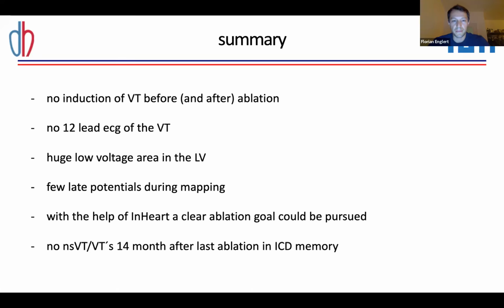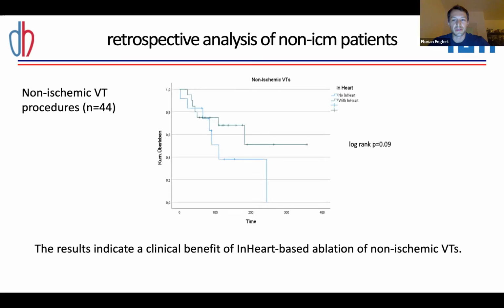We were interested because we had a few of these cases, and we wanted to compare them to cases we did before, but without the inHEART report. And as you can see here, the results already indicate a clinical benefit of the inHEART-based ablation, especially for non-ischemic VTs where you don't often have these clear targets for the ablation. Yeah, thank you very much.